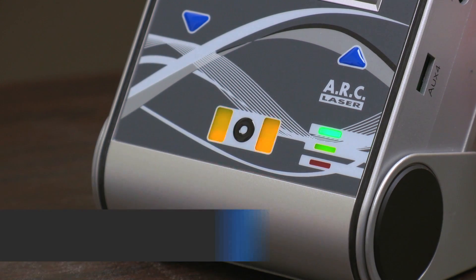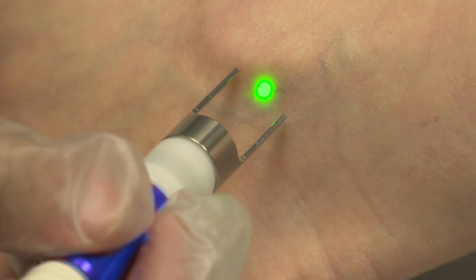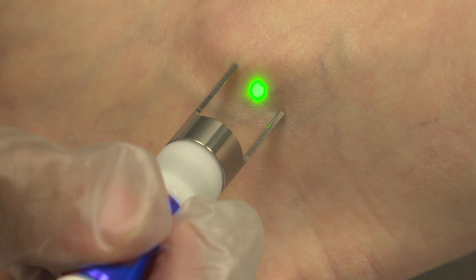Next, arm the laser by putting it into ready mode. The laser is armed but not on when the light is solid. The aiming beam will also appear when the device is in ready mode.